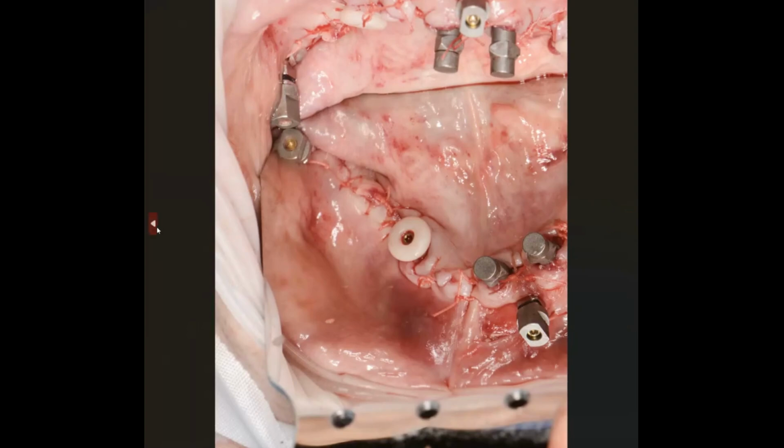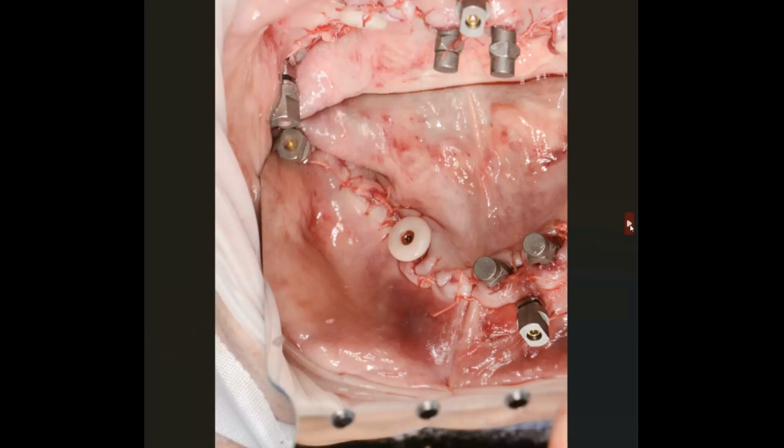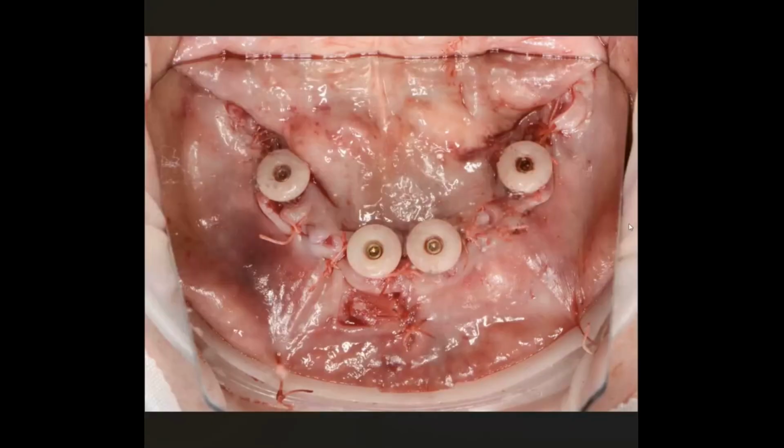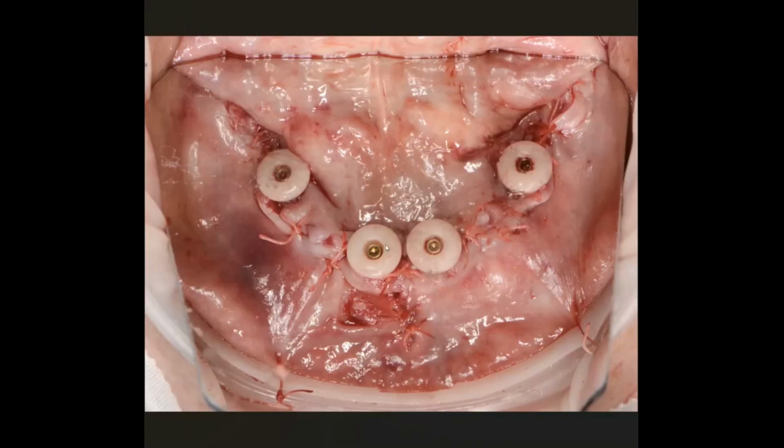Here we're showing, you can see them in the back. Again, this was just for our experiment, our little in vivo experiment. We did scans in all three directions from midline back. We did them from 17 around. We did them from 32 around. So that's what this all looks like. I'm going to save most of the results of that study, but here we are. We did our intraoral scanning, so I can just put these two healing caps on 23 and 26, and we will be ready to wake up the patient, and we'll be ready to finish the surgery.